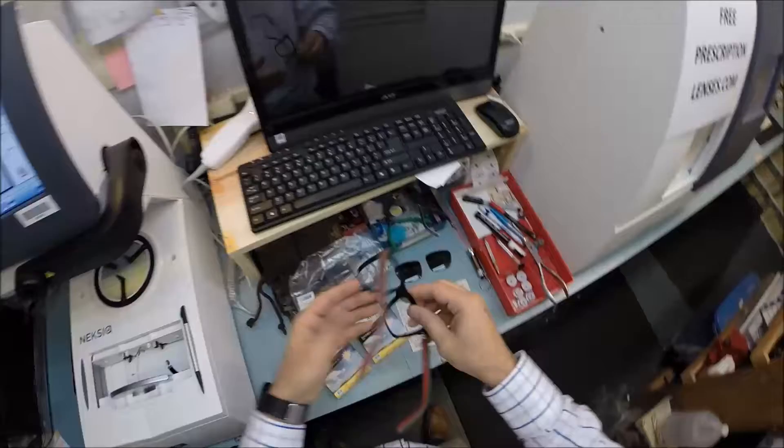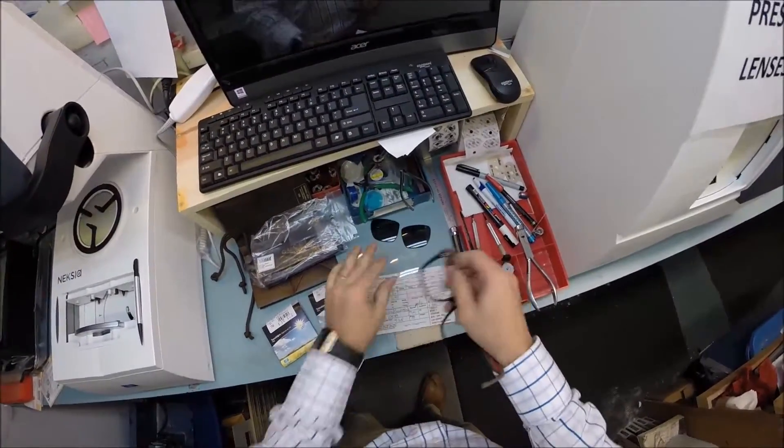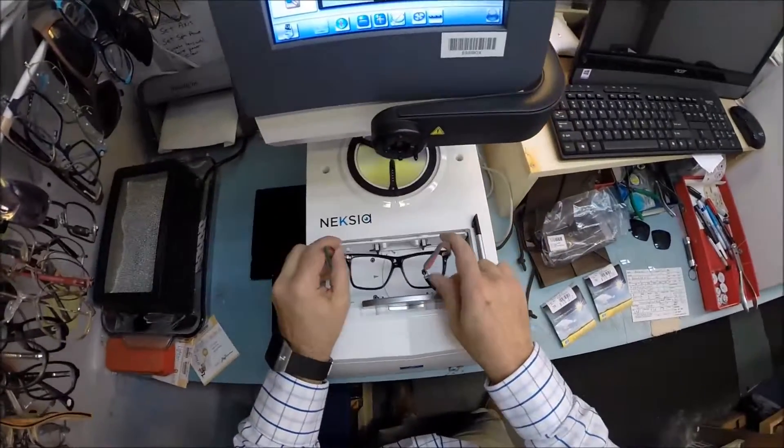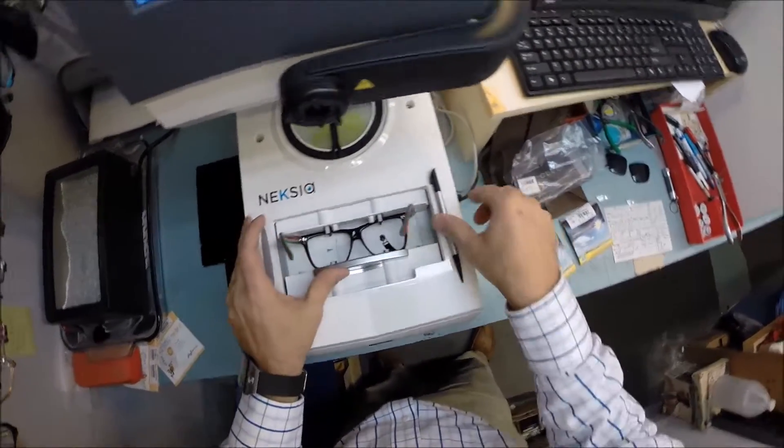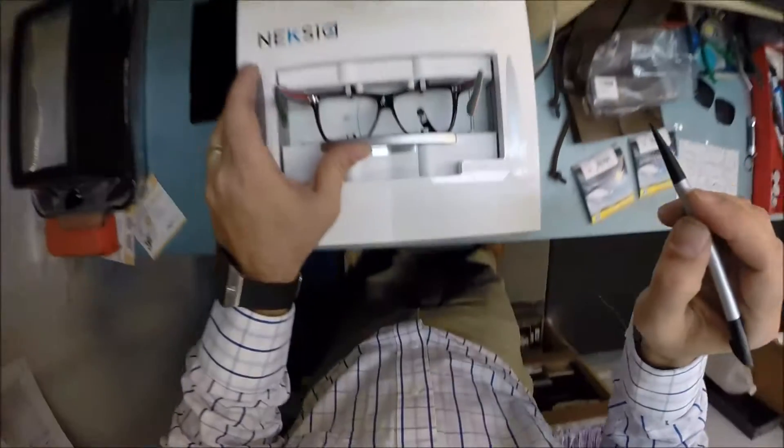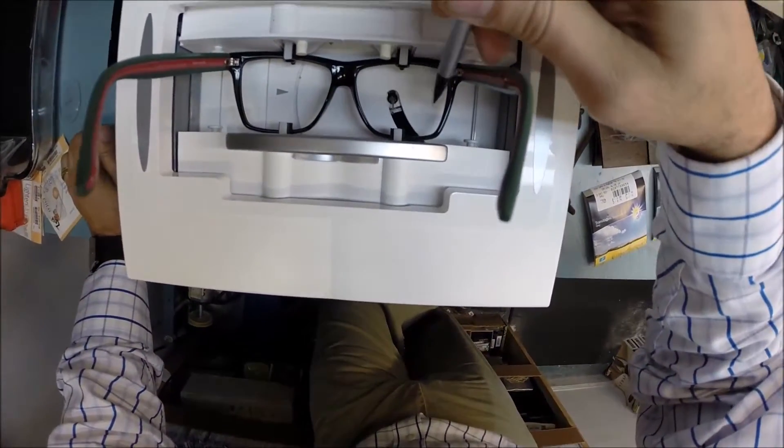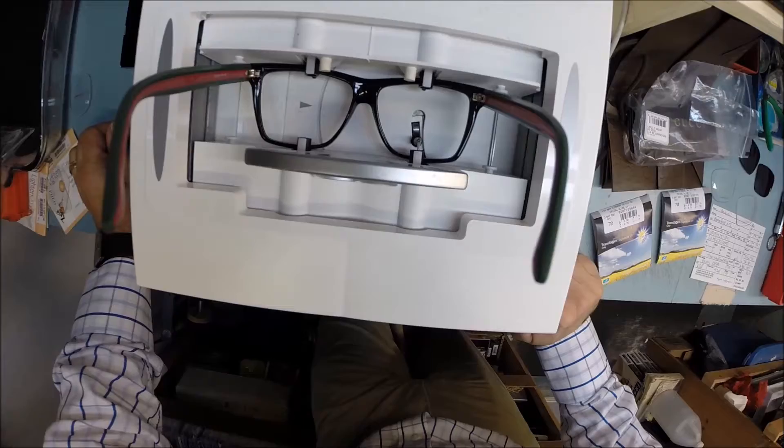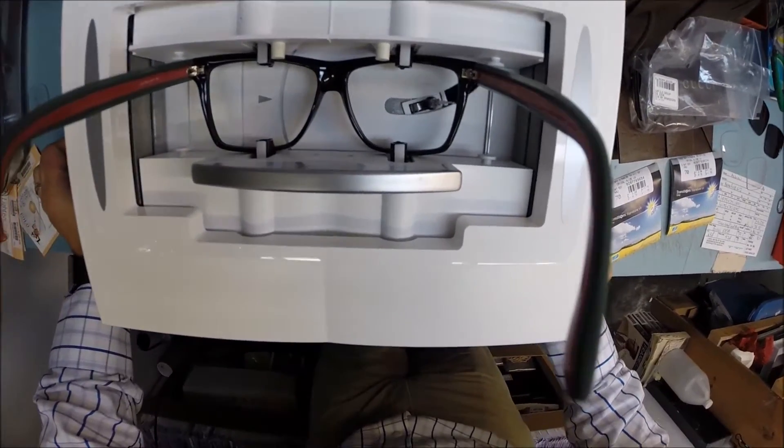I'm going to pop out your original demo lenses and put your Italian frame into my French edger and hopefully they'll get along. I'm going to wake this up and hit trace. So the stylus is going to come up and trace the shape of the right side of the frame before moving over and tracing the left.